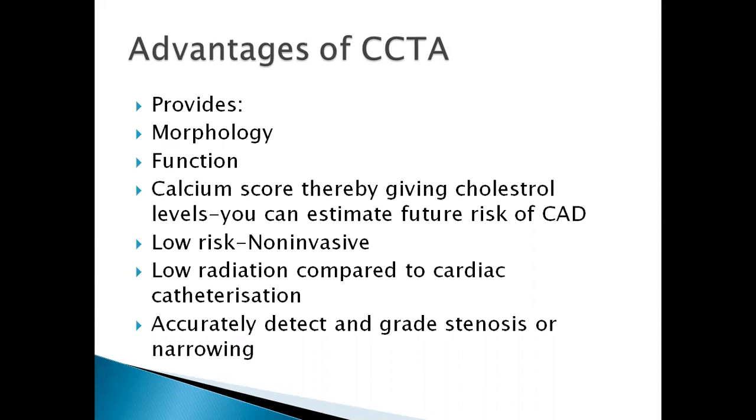And then you can estimate the future risk of coronary artery disease, even if the patient doesn't have any vessels that are occluded completely. You can still estimate, in the next 10 years, if this person doesn't change their lifestyle, what is the likelihood that they may suffer from this?